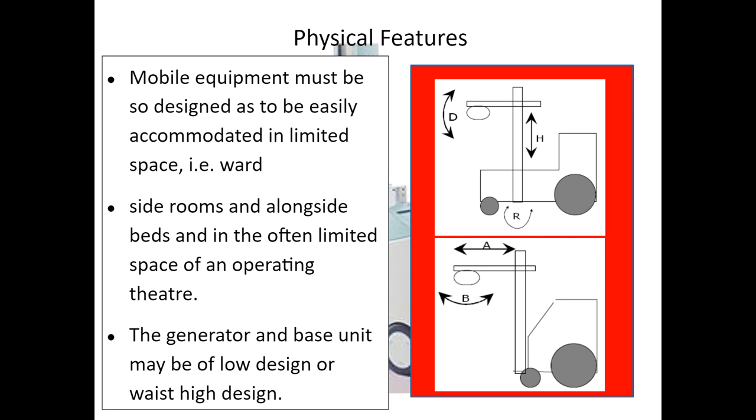So it's difficult. You can't dim the light as easily either if you want to see what's going on. It's bright sun coming through the window and you can't see your collimator very well, right? I mean, you can try to close the blinds, but you name it, there's always something to think about when you're doing a portable. That's why they become very challenging.